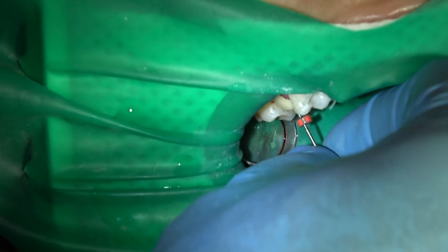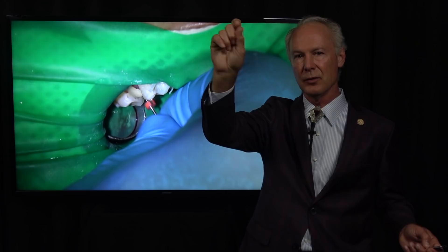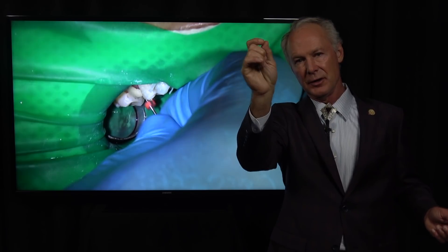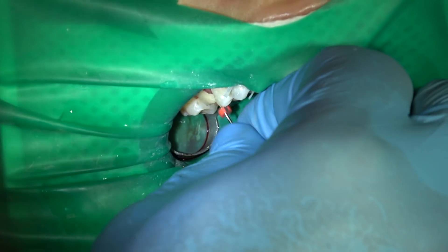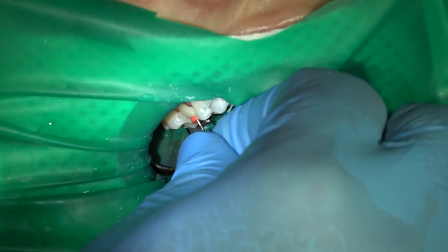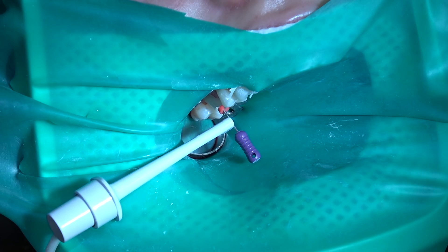Again, 0.5 on that second one. Here's the third one. Always curve the canal file and roll it in, turning your hand — kind of jiggle it as you go and roll it about half a turn each way as you go into the canal. Don't stick it straight in. Trace the canal, get to the end, and measure — this is 0.5.